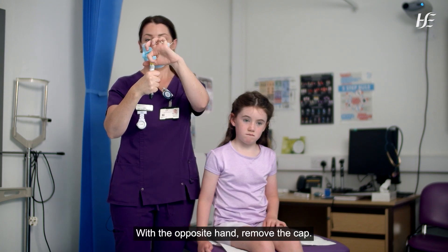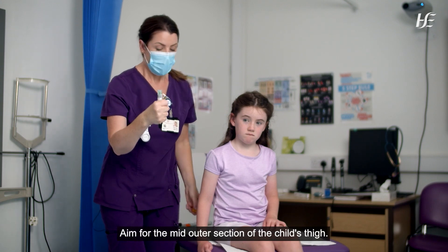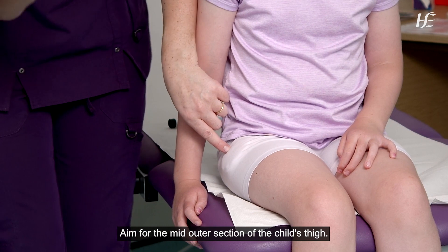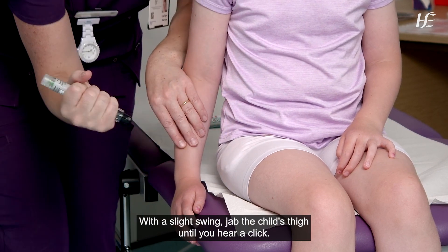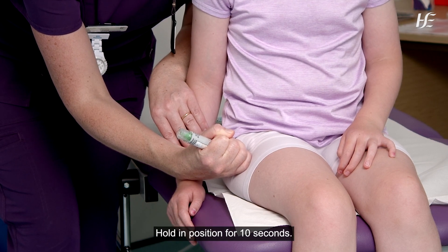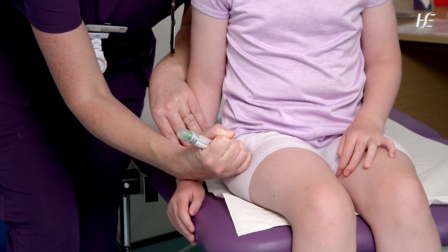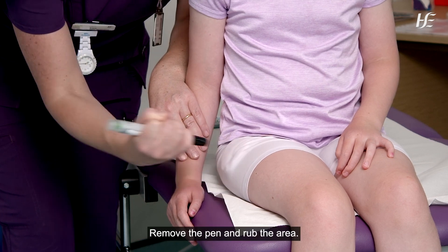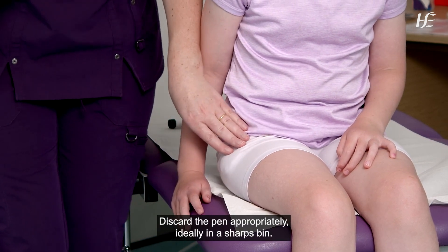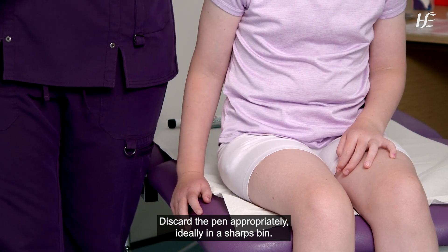With the opposite hand, remove the cap. Aim for the mid-outer section of the child's thigh. With a slight swing, jab the child's thigh until you hear a click. Hold in position for 10 seconds. Remove the pen and rub the area. Discard the pen appropriately, ideally in a sharps bin.